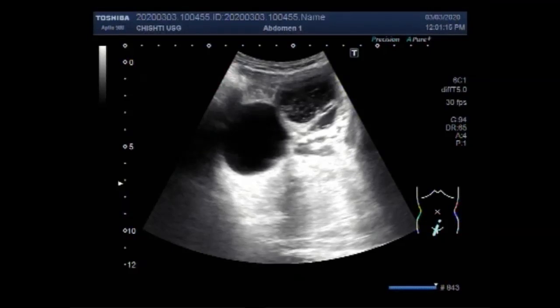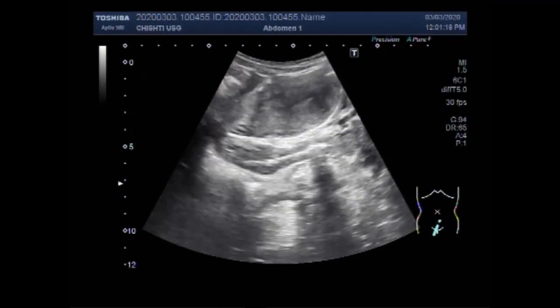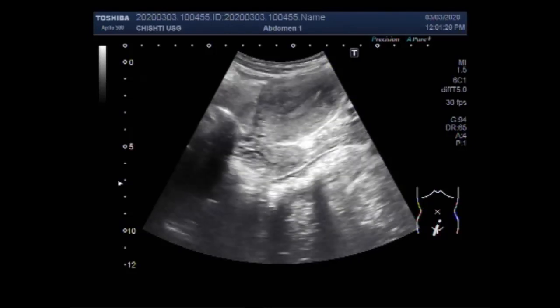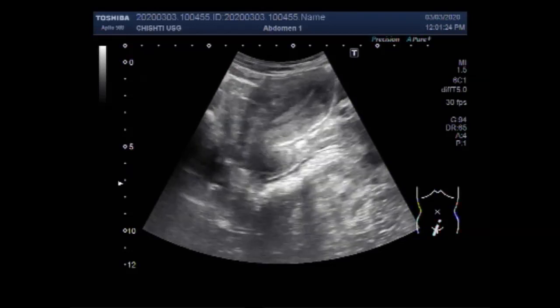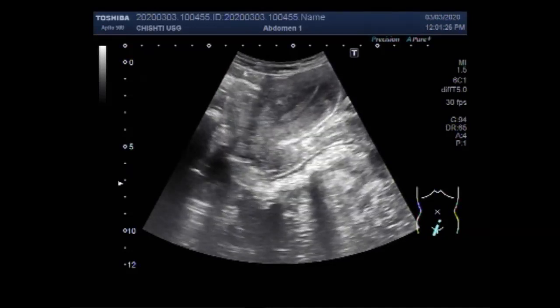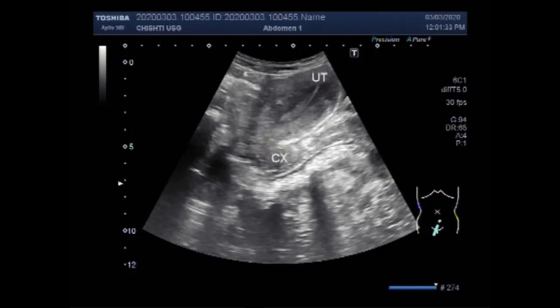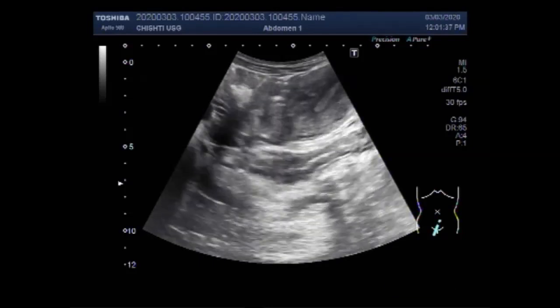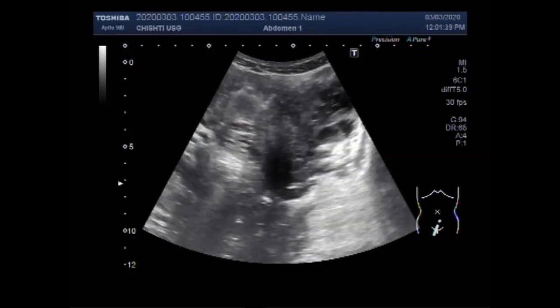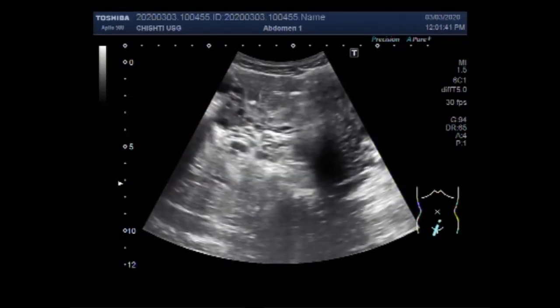This ultrasound video shows two cases: one video shows two ovarian cysts — one simple and one hemorrhagic — and the other video shows a heterogeneous uterine mass.